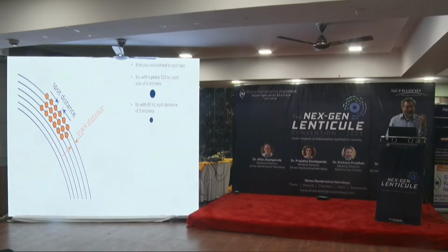Okay? So the size cannot be controlled by you. You cannot control the spot size, you understand? The spot size cannot be controlled by you. What you can control is the energy, the pulse energy. You can increase or decrease the pulse energy.